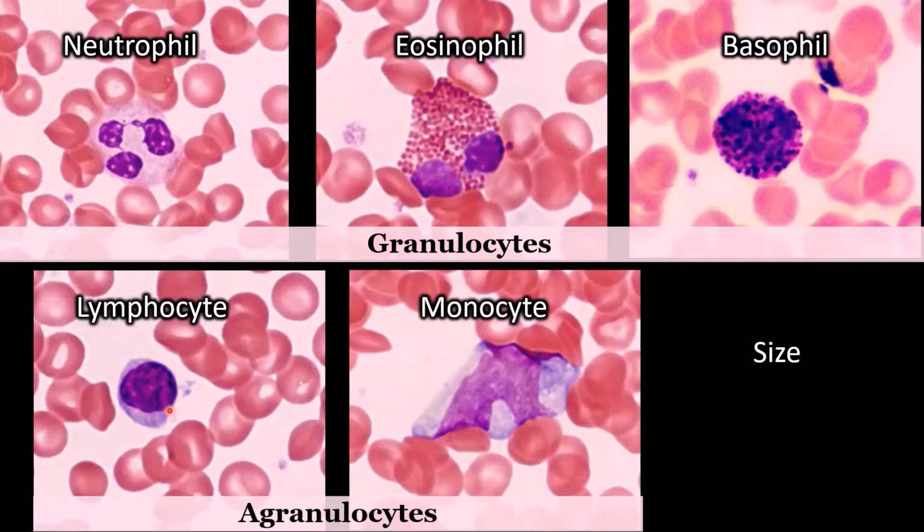So you might have more or less cytoplasm, but you're always going to have your nucleus be about the size of 1 red blood cell. And the monocyte is the biggest one. You could easily fit 5 red blood cells in there, and that's probably the quickest way to tell it's a monocyte. It's just the fact it's so large.